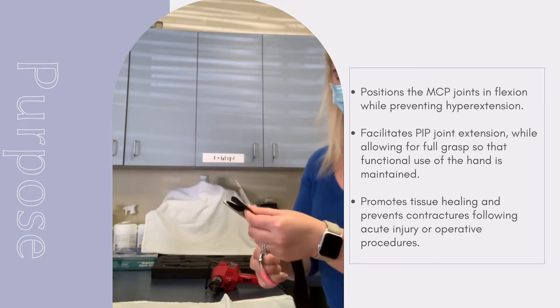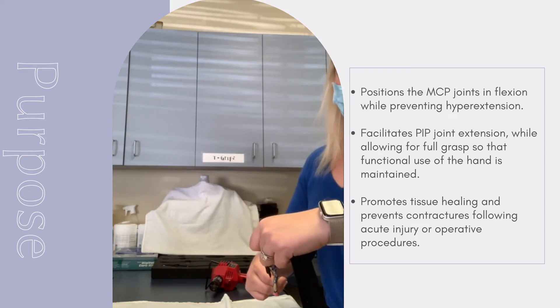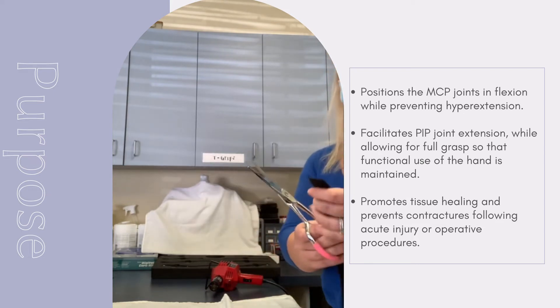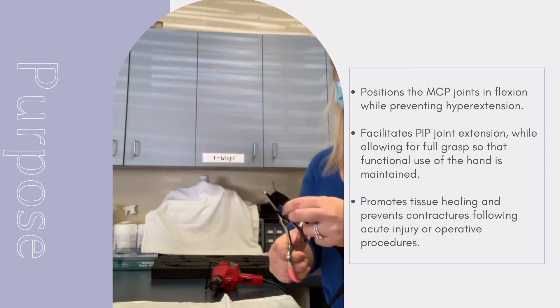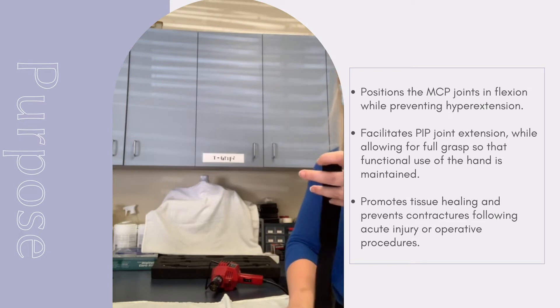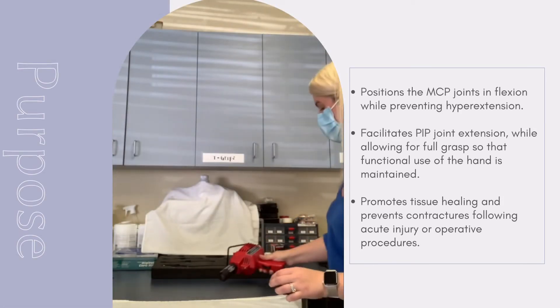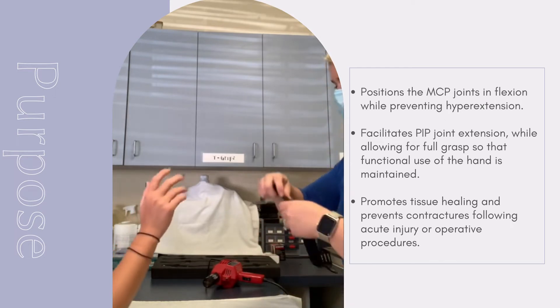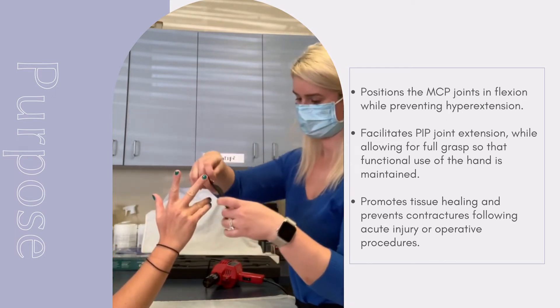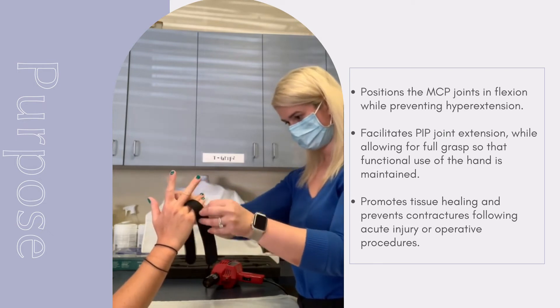Once anchored, you should make note of any potential areas that could be uncomfortable for the patient or could be restricting movement. We can trim these areas as well as round the edges while we make the finishing touches to the orthosis.